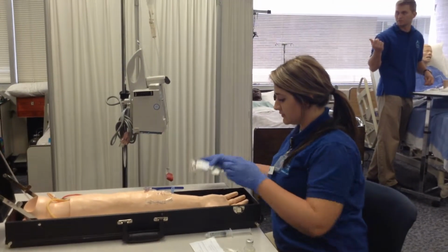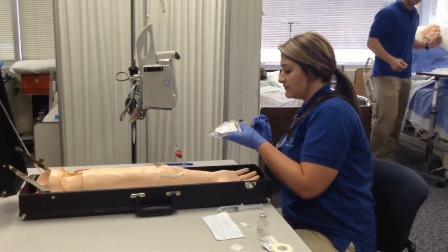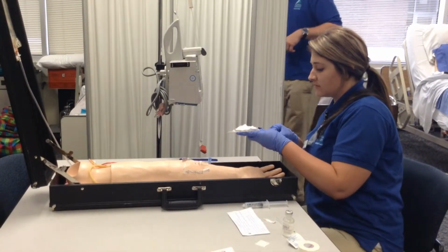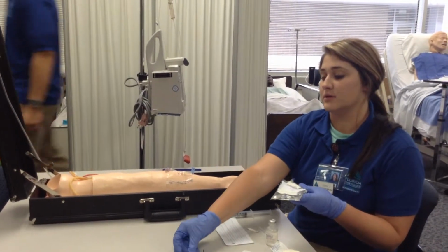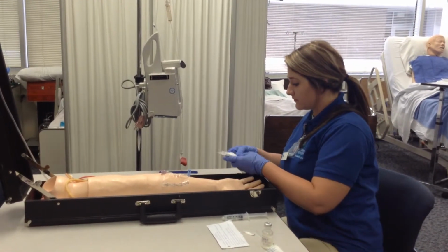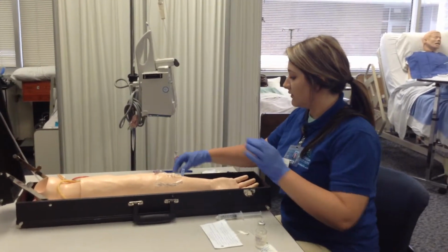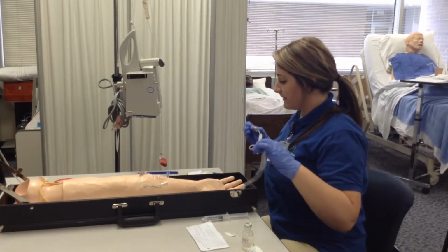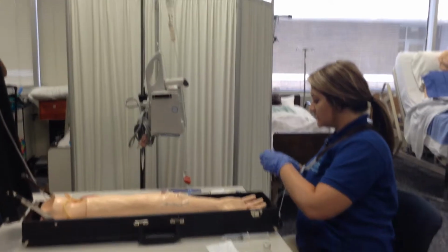So now I'm going to insert my medication into my mini bag. I will discard my needle, dispose of it in a sharps container, and I'll change it when it's 2/3 full. Now with my mini bag tube already labeled with my client's name, the date, the dose, and the time, and my initials.